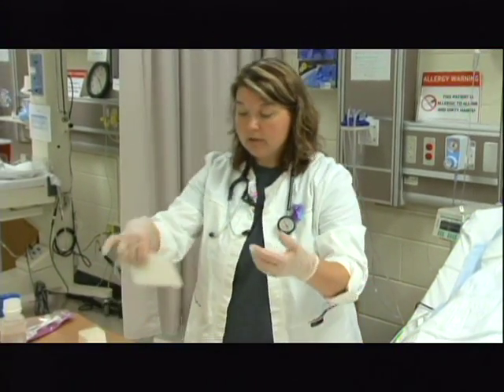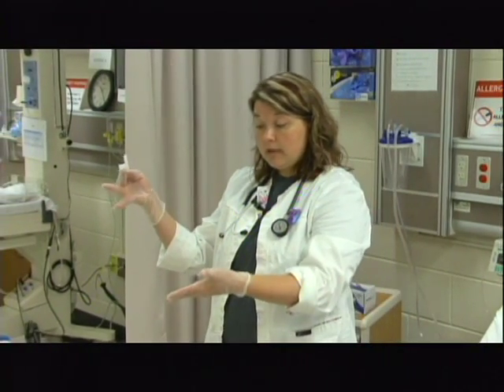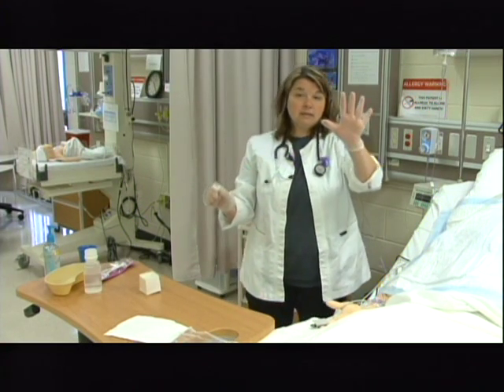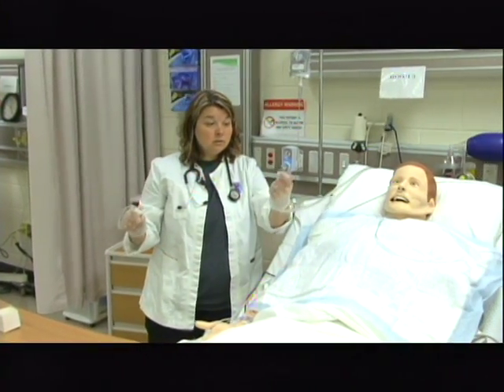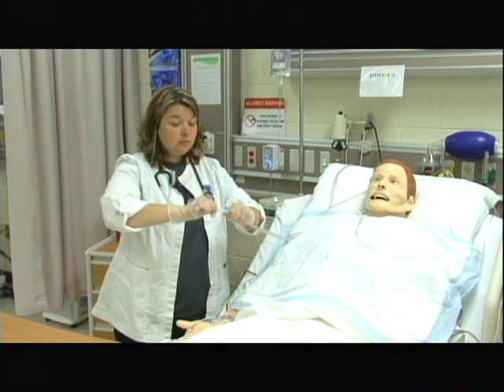My catheter is still sterile, so I'm going to come over and take the catheter out of the package. Anything I need to get rid of, I can drop in the trash receptacle as long as I don't go below waist level. I need to examine the catheter to make sure it's clean, dry, and intact with no issues. This is the suction piece and at the end is the suction control. I wrap the suction catheter around my hand with the suction control here. I'm going to contaminate my non-dominant hand by grabbing the suction tubing I've already checked, and my sterile dominant hand will connect the catheter to the suction tubing.